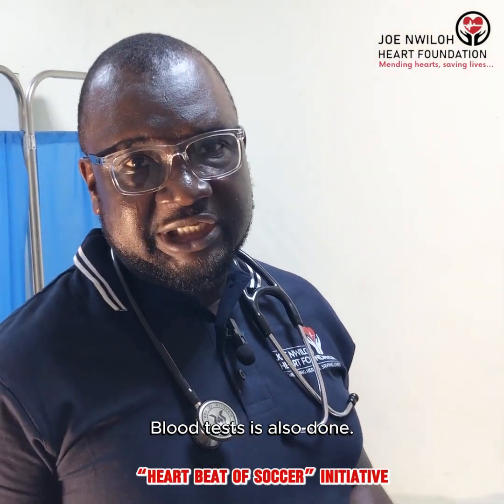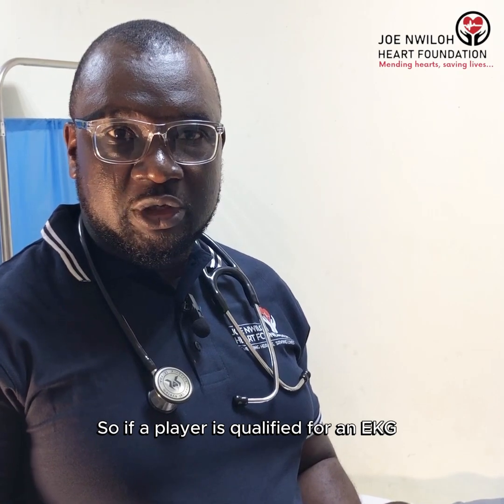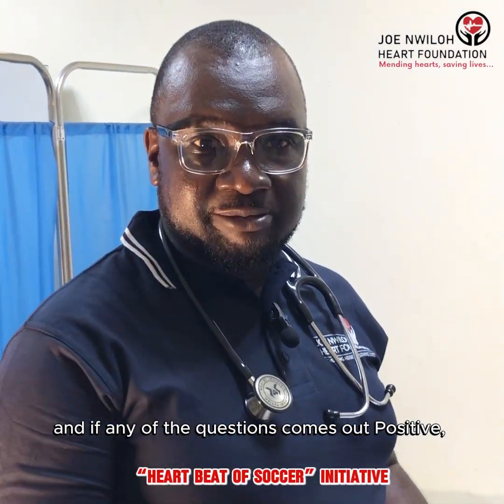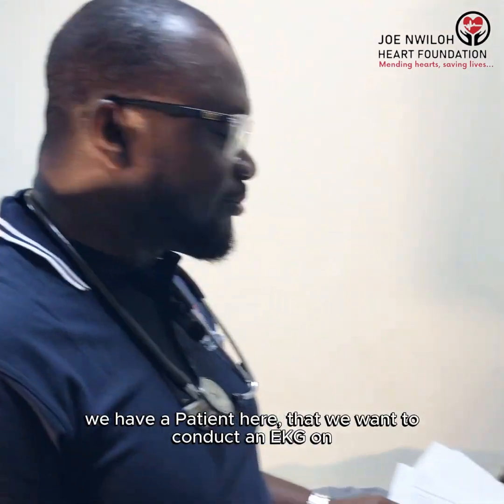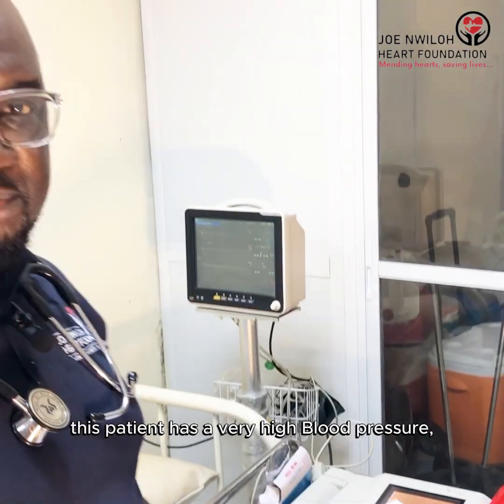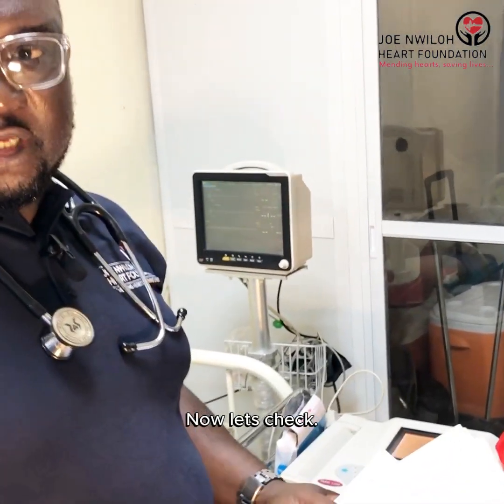So we also do blood tests and all of that. So if a player is qualified for an EKG and the player is in line with the questionnaire, and maybe from any of those questions is yes, we can conduct an EKG. So we have a patient here that we want to conduct an EKG on, and this patient's BP is actually very, very high. We have a systolic of 185 and diastolic of 104. So let's check the electrical part of this patient's heart. That's what we want to do now.